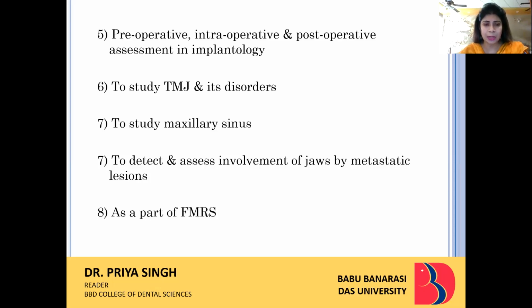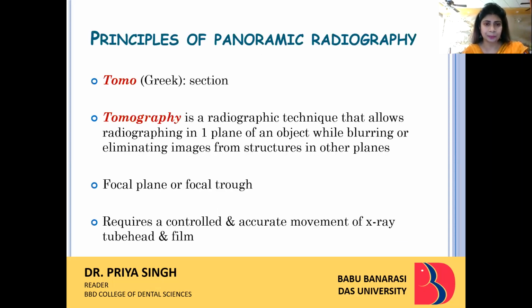Apart from this panoramic view, we can advise different other extraoral views to detect and assess involvement of jaws by metastatic lesion. If it's not the primary lesion but the secondary lesion, then also we can identify that by seeing this radiograph as a screening radiograph. And finally, as a part of FMRS, which is full mouth radiographic survey, where you want to administer different treatment modalities.